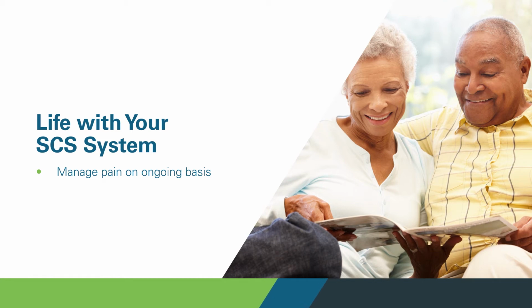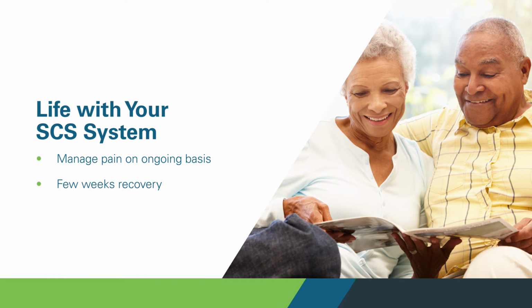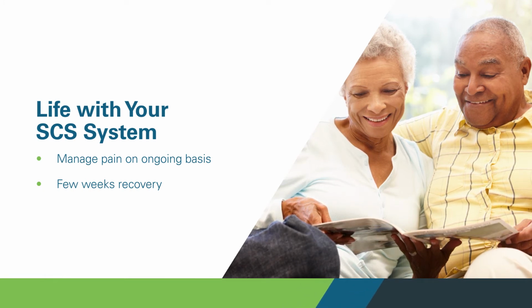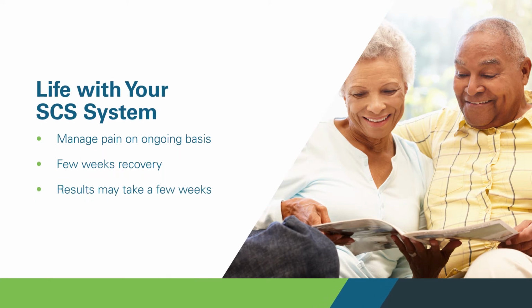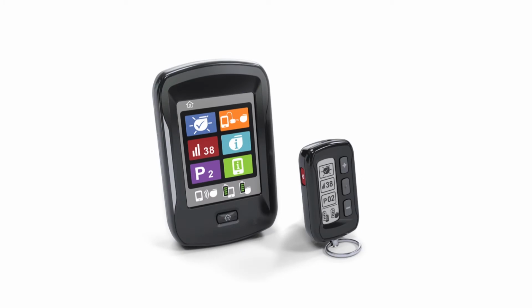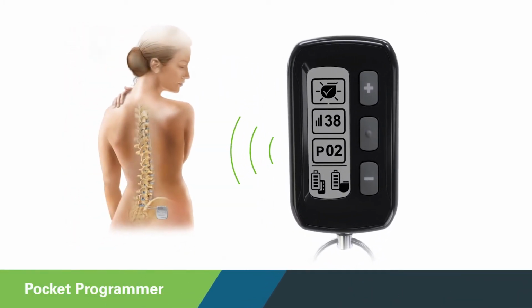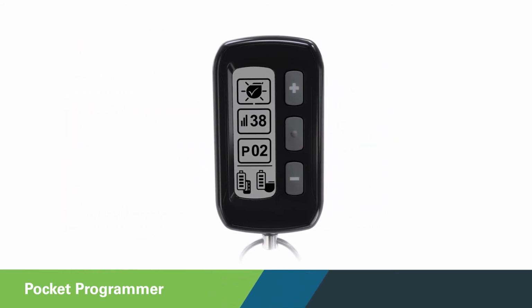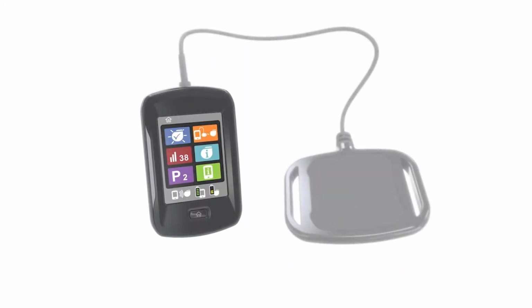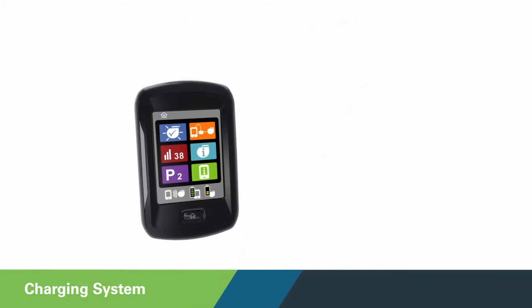Once you've had your system implanted, you can expect a few weeks of healing time from the procedure. Some people experience pain relief right away, while with others, it takes a few weeks before results are seen. You'll receive 2 devices to help manage your pain. The first is your pocket programmer for adjusting your stimulation on the go and is designed to fit into your life easily and discreetly. You'll also receive a charging system for recharging your IPG at home and adjusting programming at home.